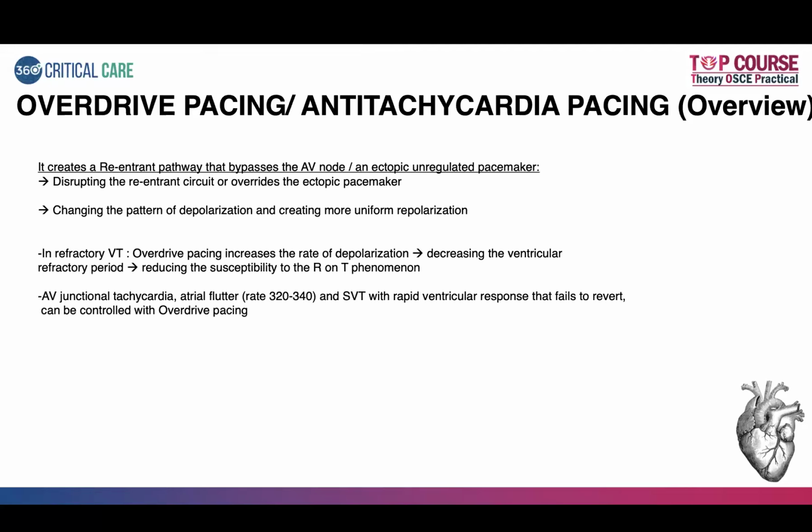So patients with an AV junction tachycardia, atrial flutter, and SVT with rapid ventricular response that fail to revert to conventional therapy, overdrive pacing can be used. And usually they say to keep an external rate of 10 to 20 beats per minute greater than the native rate.